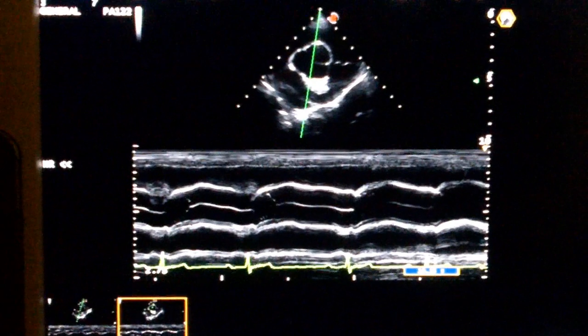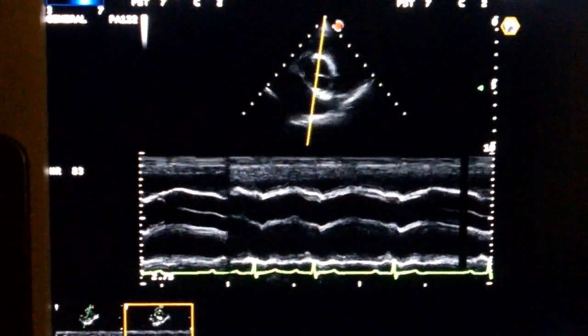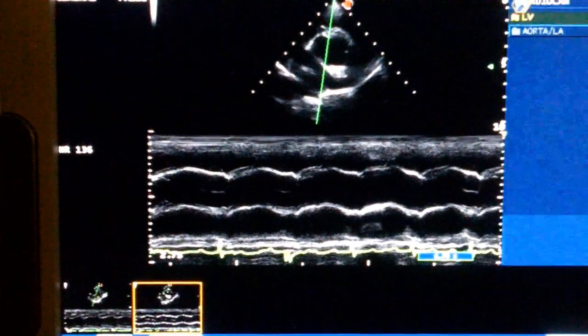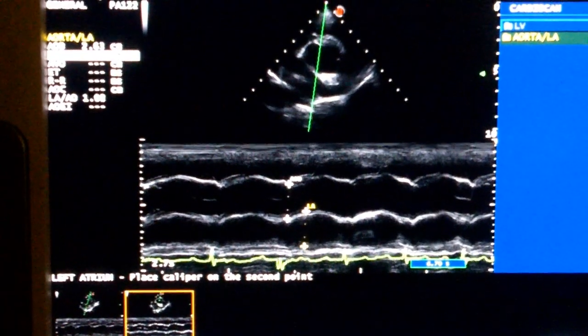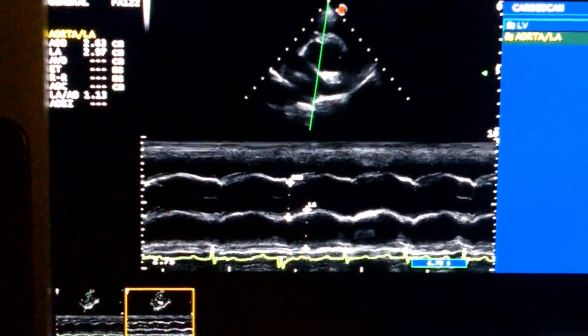What we can also do is get a rough approximation of the size comparison of the left atrium to the aortic outflow tract. So that's a pretty decent ratio.